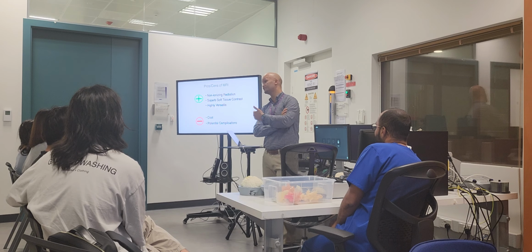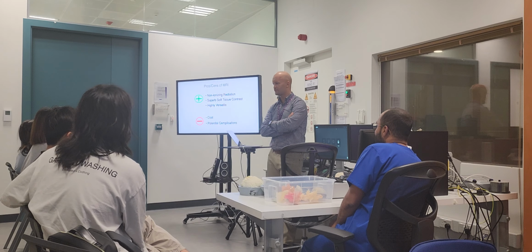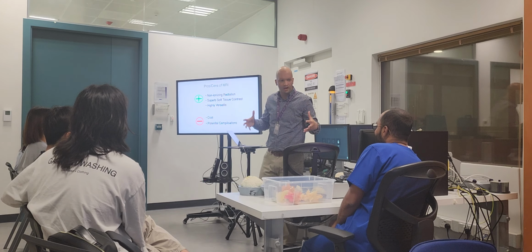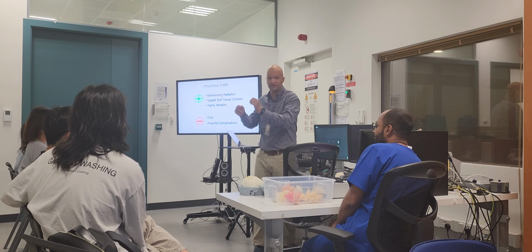We call it the missile effect. In our environmental health and safety risk assessment, what are the risks associated with MRI? Missile effects. It has a name actually, because things fly like a missile inside. That's why I will not trust a huge group inside the magnet room with a subject, because I don't know. I have to screen each one of them.